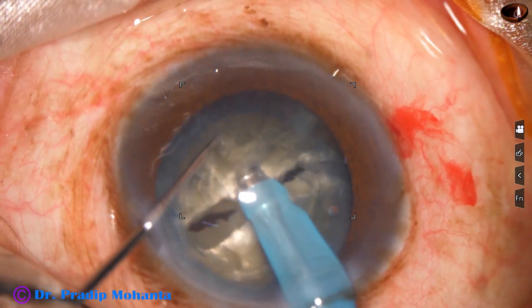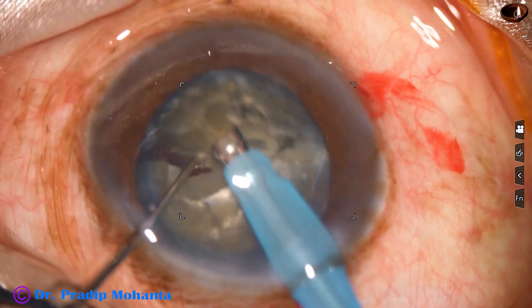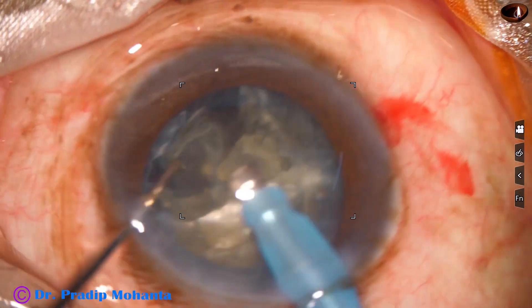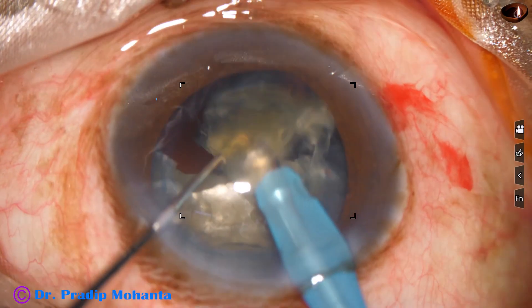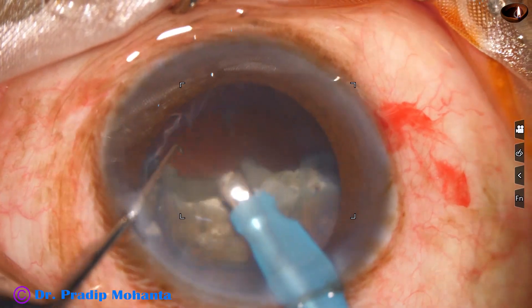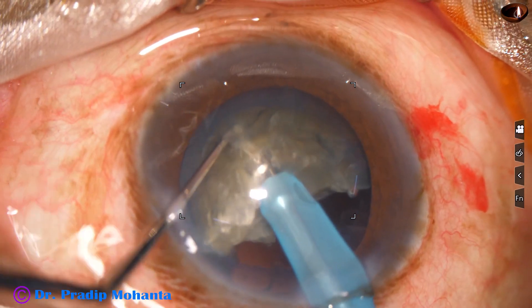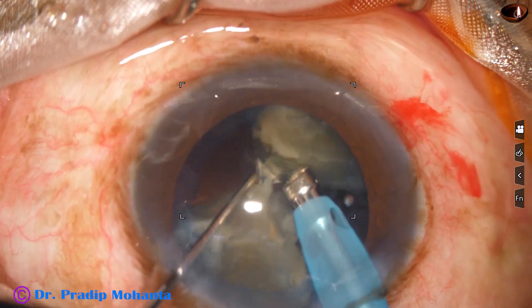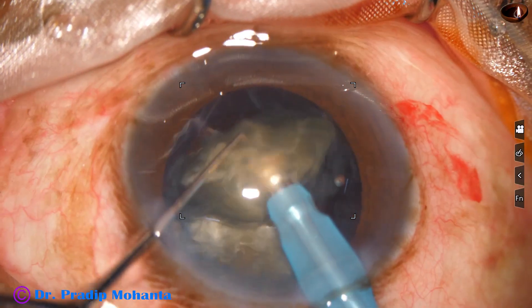In this case the nucleus has been completely separated into two hemi nuclei, and one hemi nucleus has been nicely subdivided into two large pieces. Each large piece is emulsified and if necessary it is again divided into smaller pieces. Now I bring the other hemi nucleus in front of the phaco needle — it is also divided into two pieces — and then all nuclear pieces are managed in this way.